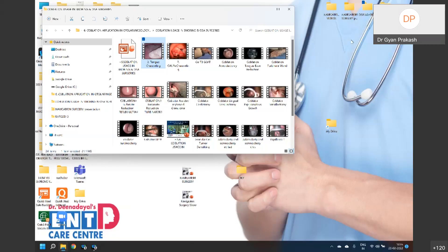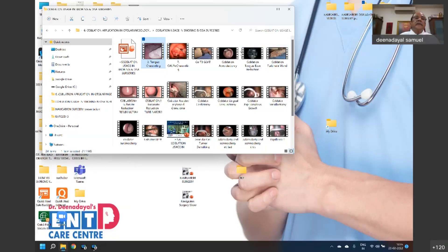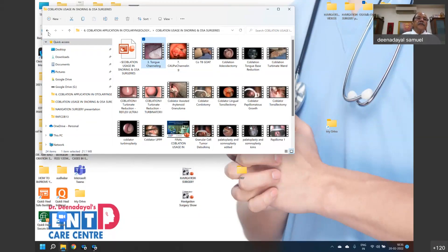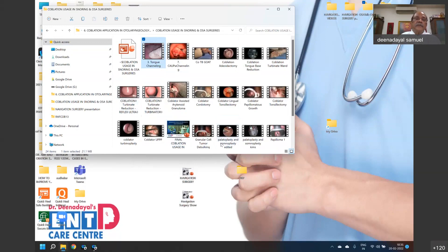This gives an idea of how co-ablation can be used in snoring and obstructive sleep apnea. There are also zeta palatoplasty and uvulopalatopharyngoplasty videos available.